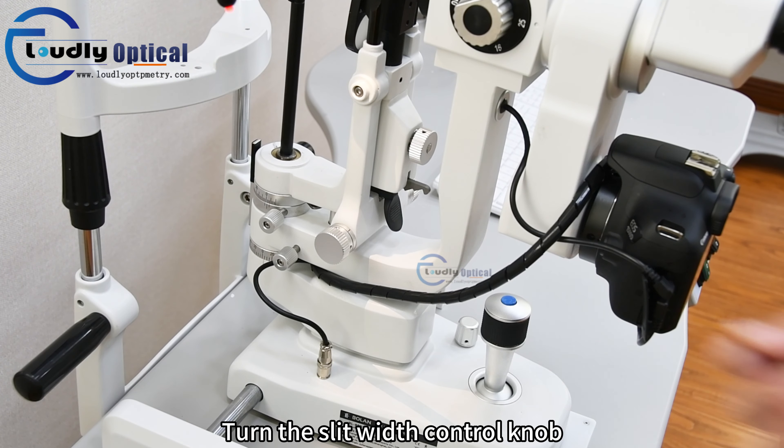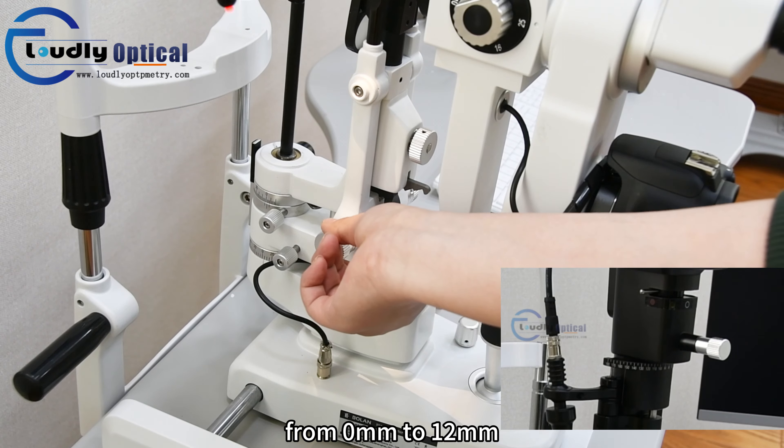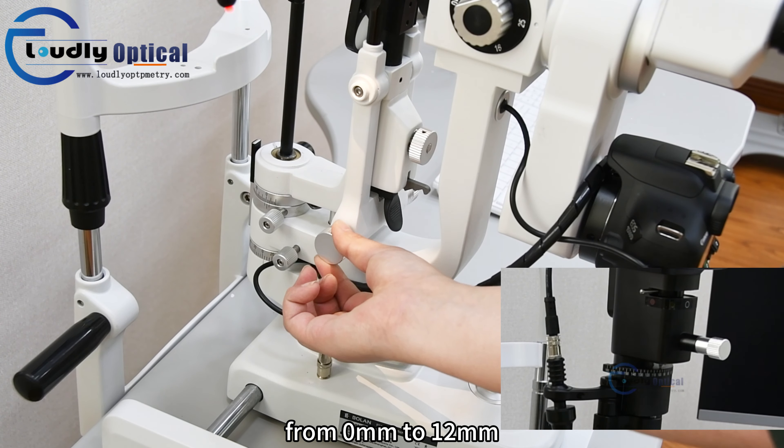Turn the slit width control knob. The slit width can be changed from 0 mm to 12 mm.